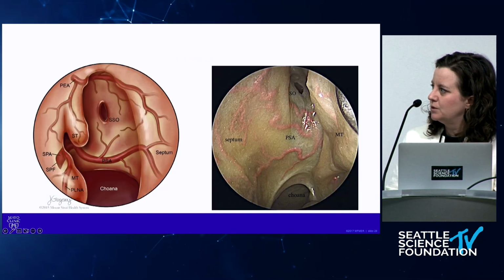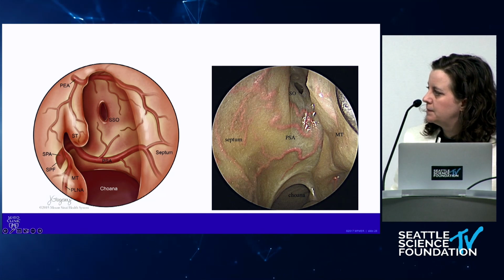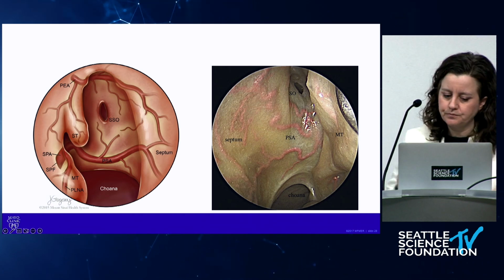Okay, a couple of things to watch for if you're doing a sphenoidotomy. This posterior septal branch from the sphenopalatine artery, if this is a right side SPA, sends that branch across the face of the sphenoid and onto the septum. This is from the opposite view on the left. Sphenopalatine, posterior septal branch onto the septum. If you're doing a sphenoidotomy and you're coming way down, the odds are you're going to hit one of those branches. These are the branches we need for our nasal septal flaps. We know those are robust arteries. So if you're coming down, be aware that you may come across that vessel.